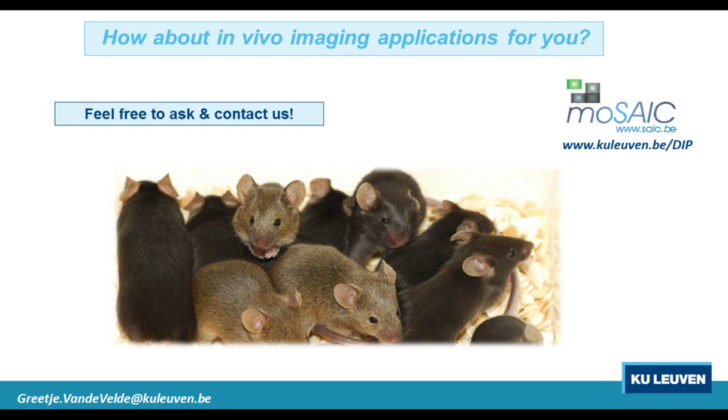And for the lung scans, it depends. You can also do a very good lung scan at 3 minutes, but if you want the 4-dimensional lung scan, which means that you have a scan at end of expiration and inspiration, so that you can extract functional information, then you are looking at a 10 minute scan. So it depends a bit.